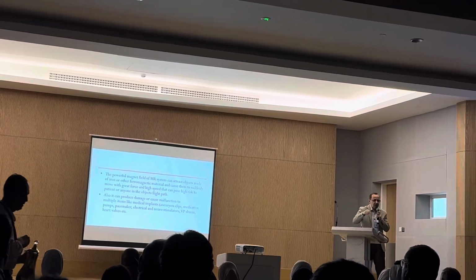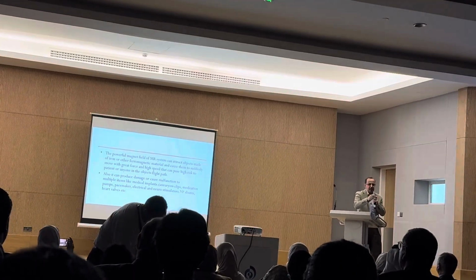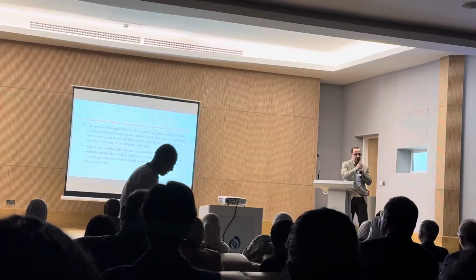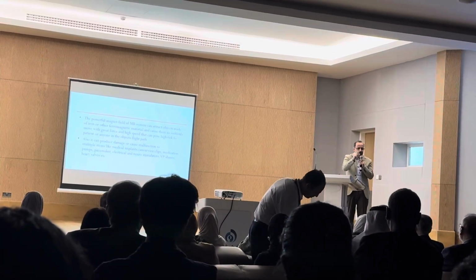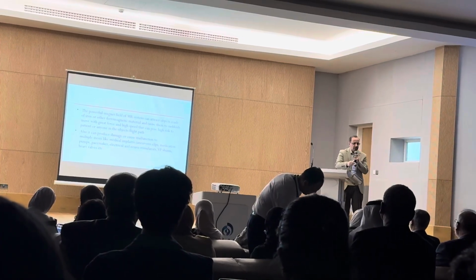Thus, anything along this flight path will definitely be harmfully and severely injured, including the patient, of course, who is our priority. It might lead to a deadly accident and severe injury. The force of the projectile effect, you cannot imagine it. In 1 second, you will see this object flying and going into the magnet bore.